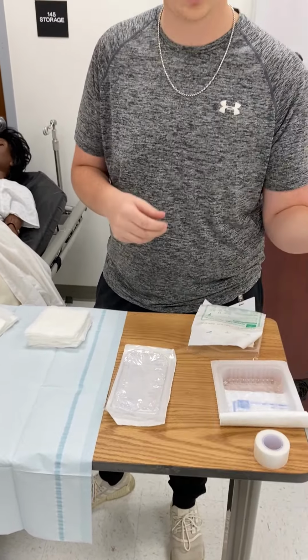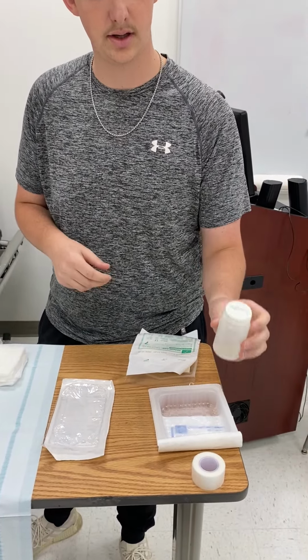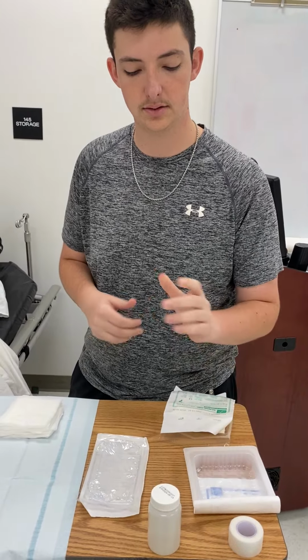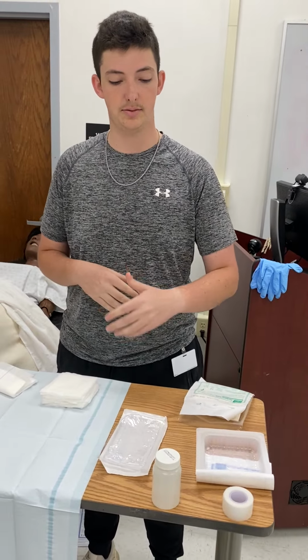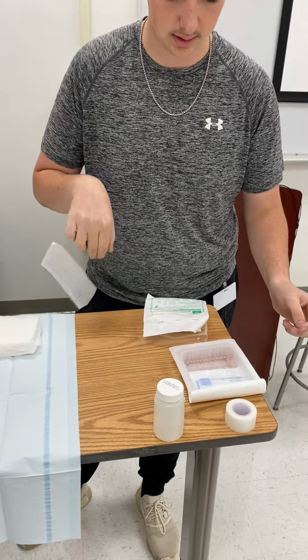Okay, so now using water, grab it by the label. Look. Okay, and all the water was used. If it was not used, I would then date, initial. That way, if we were to use it later, they would know who opened it and when it was opened. Alrighty, now I will get that out of the way.